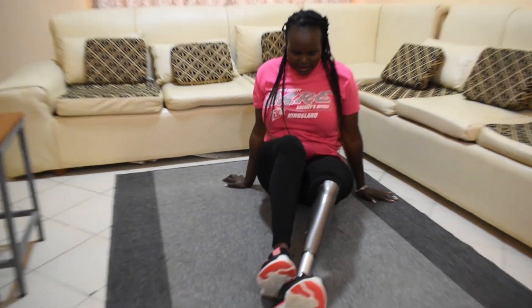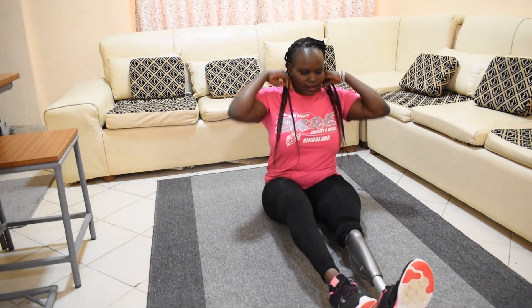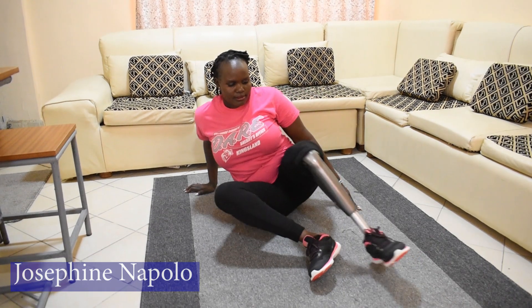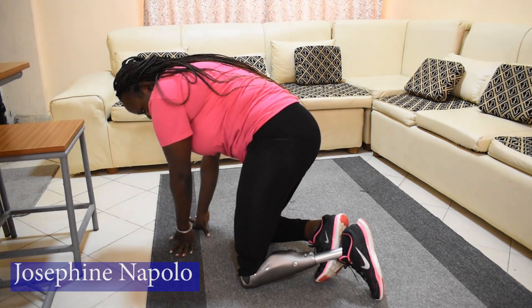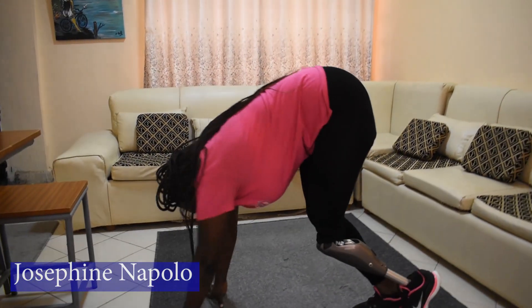One of my amputee friends asked if I ever fell down. Yes — I used to fall frequently, but for the last three years with my current prosthetic leg, my falls have reduced to minimal.